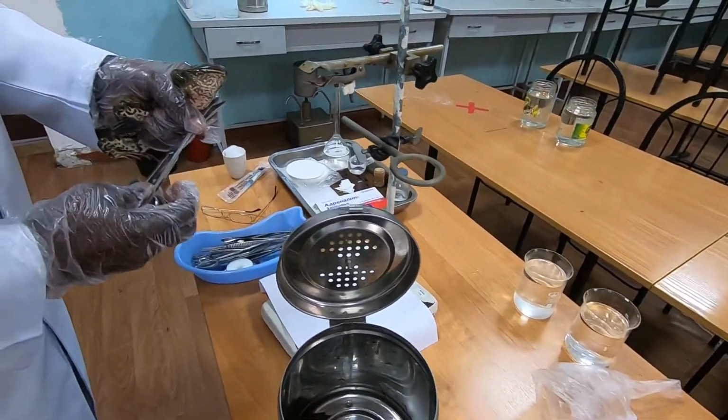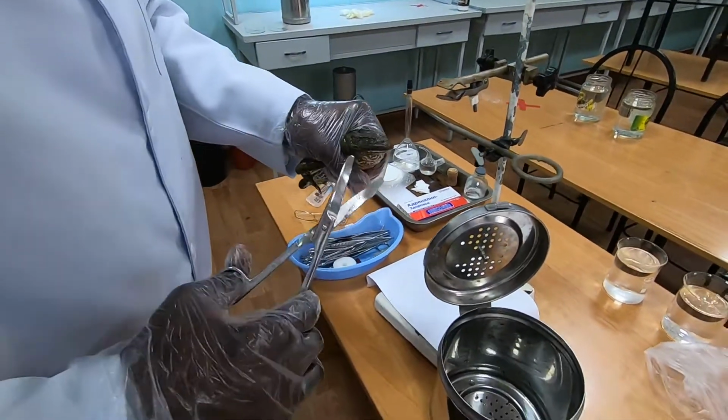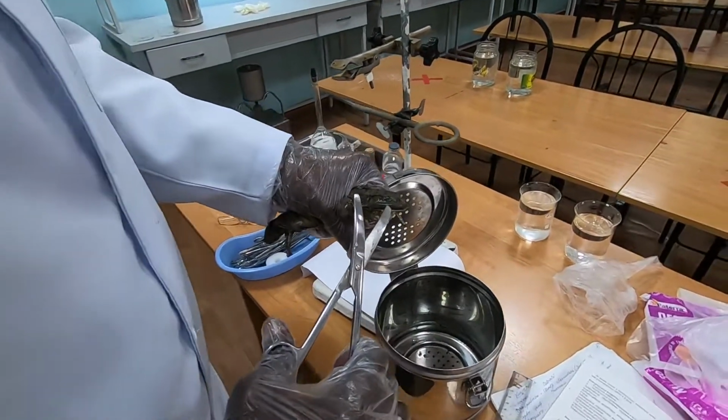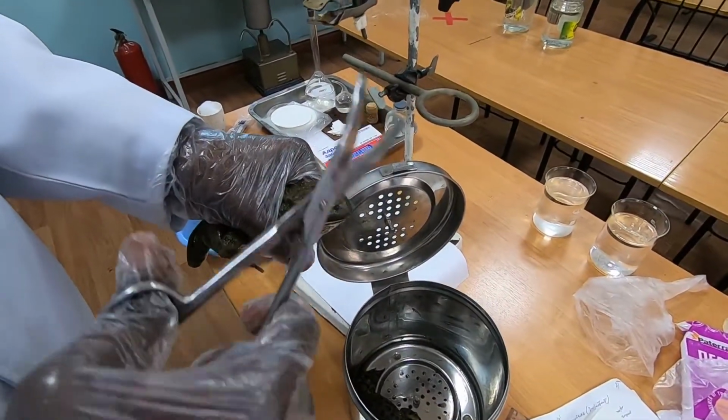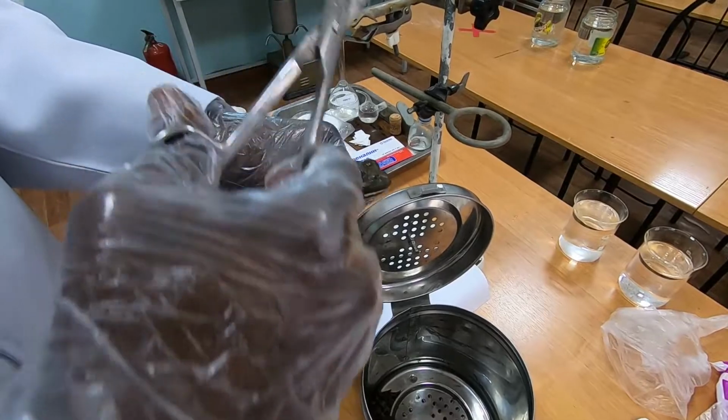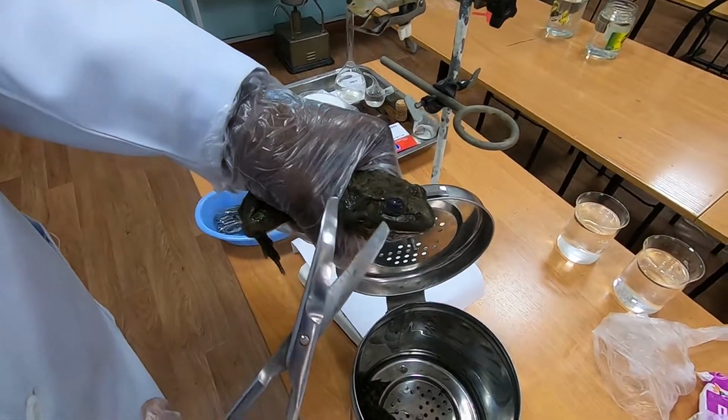We take our scissors, right, as usual. I mean, we can use one frog for both experiments, yeah, if it is possible.